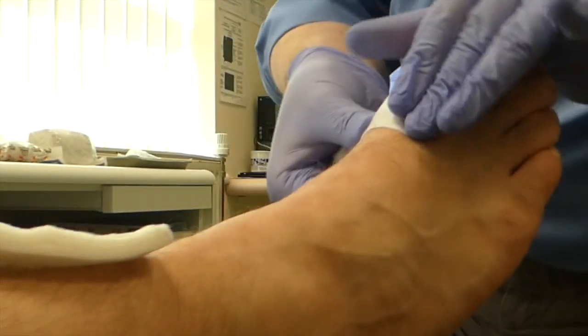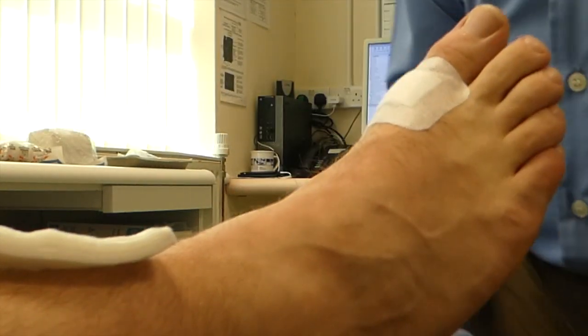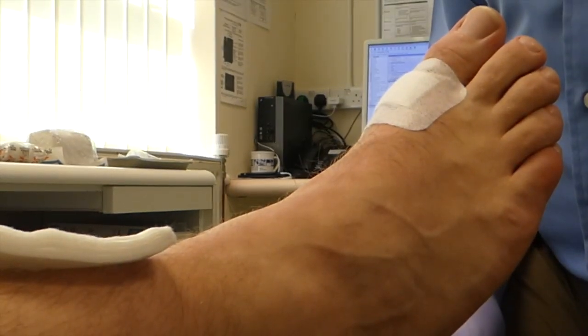Little bandage — which is, actually, French for bandage — and that goes on there. And we're done. 30 seconds, £200 — thank you very much.